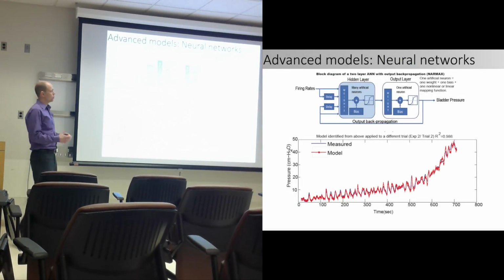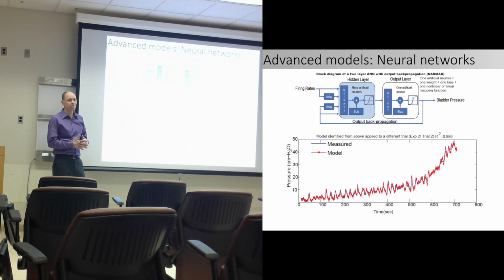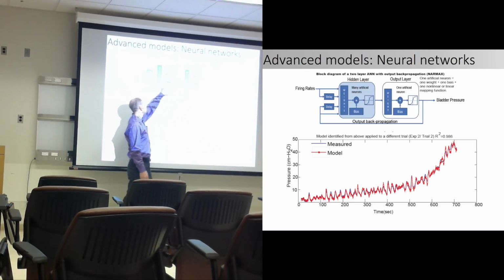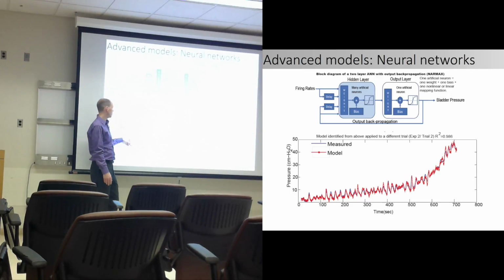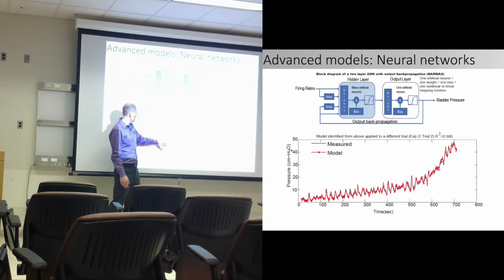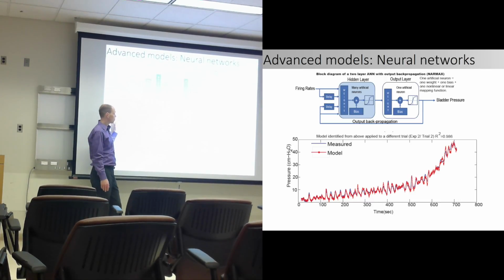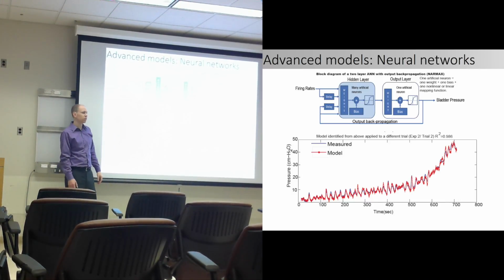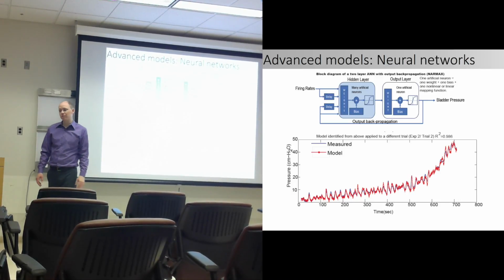So one of the different ways of approaching this is evaluating the use of what are called neural networks. What this essentially does is add a lot of extra terms in the middle between the neuron firing rate and the bladder pressure. And so far we're seeing really good fits to our measured bladder pressures, which we trace in the background. In this trial, we used a model from earlier in the experiment, and the fit was pretty nice. All of these are short-term experiments, just looking at different states across a matter of hours.